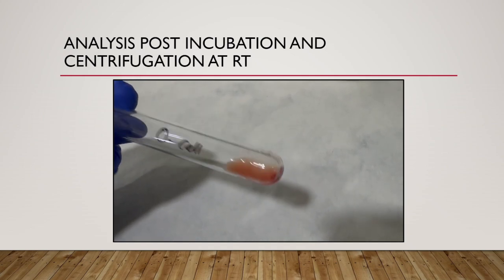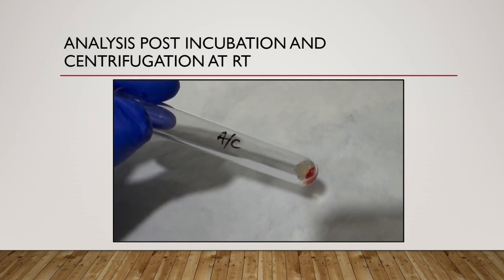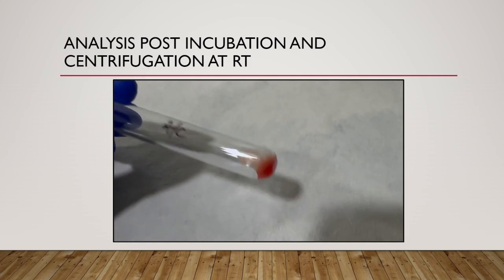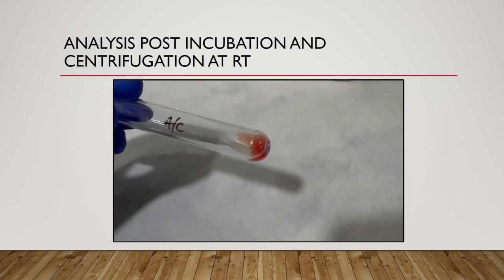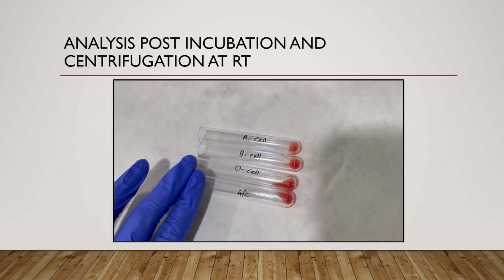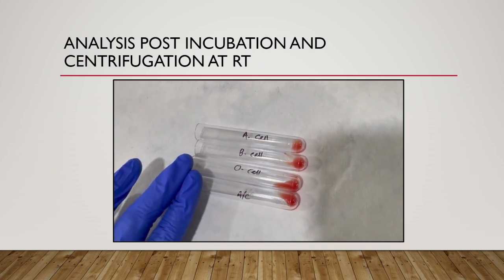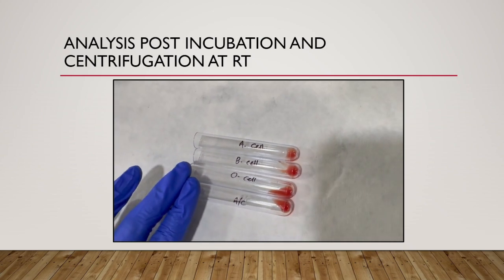O cell also there is no agglutination. Autocontrol tube also there is no agglutination. Here we can see that there is no agglutination reaction in all the 4 reverse grouping tubes, hence the group of A positive cannot be confirmed.